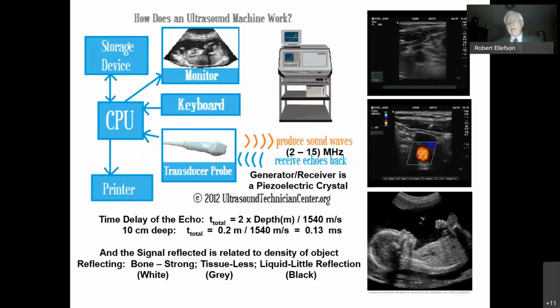So as you look on the right, there are a few ultrasound images that have been created, and some of them have a dark spot in the middle, like here, and that implies that these are liquid-filled regions that are coming back, and so it could be a cyst that is filled with liquid as opposed to a tumor, which is full density.